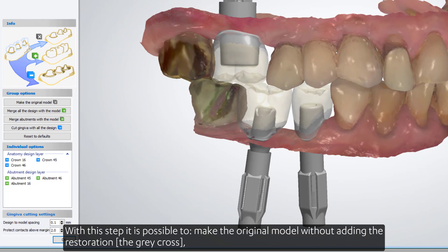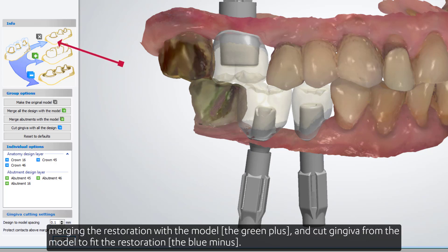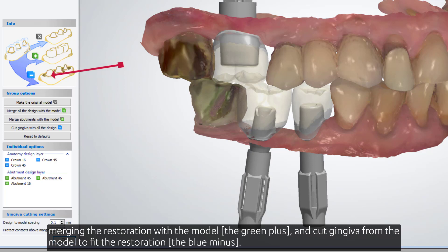With this step, it's possible to make the original model without adding the restoration — the grey cross — merging the restoration with the model — the green plus — and cut the gingiva from the model to fit the restoration — the blue minus.